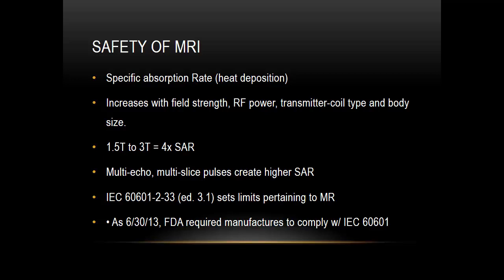When you go from 1.5 to 3T, the SAR increases almost 4 times. So there's not a doubling of SAR, it goes 4 times up. Now, your multi-echo, multi-slice sequences do create a higher specific absorption rate as well.